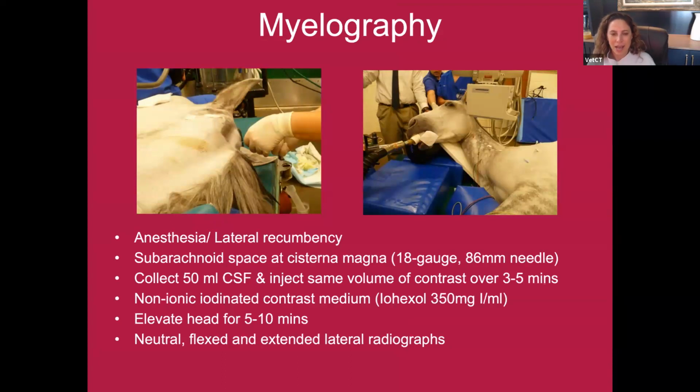And in the end, they can have a relatively good sensitivity and specificity, but we really still use that to say, okay, now we're really concerned. We have subjective criteria, we have objective criteria, we have clinical evidence, and the final step to sort of prove that we have compression would be a radiographic, or nowadays CT myelogram.